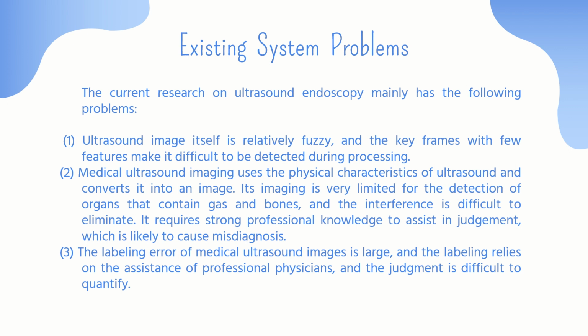In the recent years, ultrasound imaging in the medical field converts the physical characteristics of ultrasound into an image. However, its effectiveness and impact is very limited for detecting organs which contain bones and gas. Eliminating the interference between them will be very difficult. Since it includes too much complexity, high professional experience and knowledge is required to give precise judgments, or else it may lead to the risk of misdiagnosis.